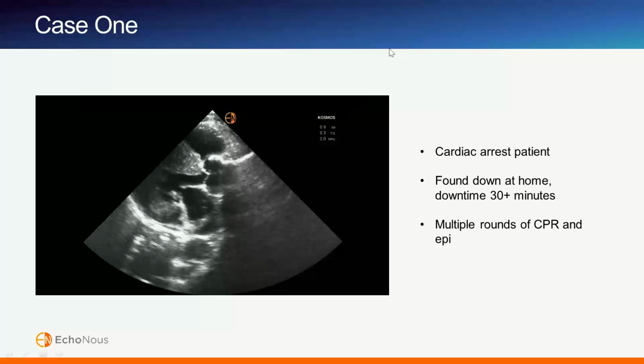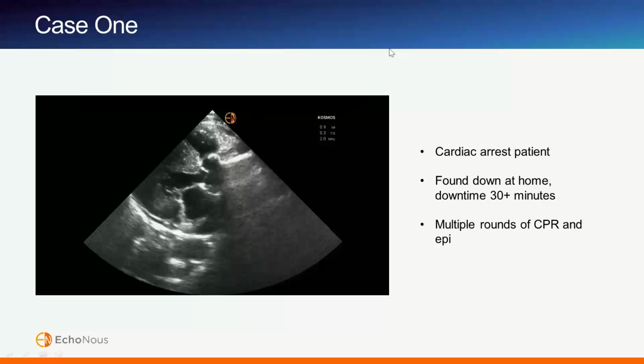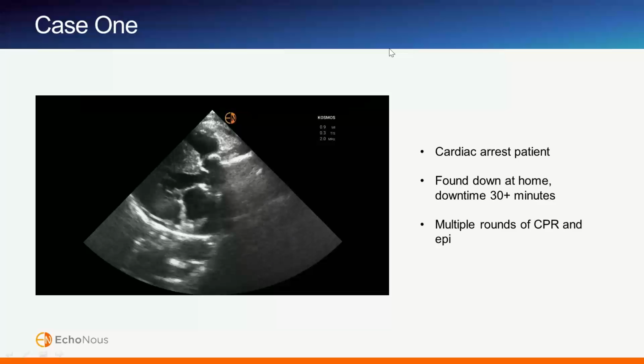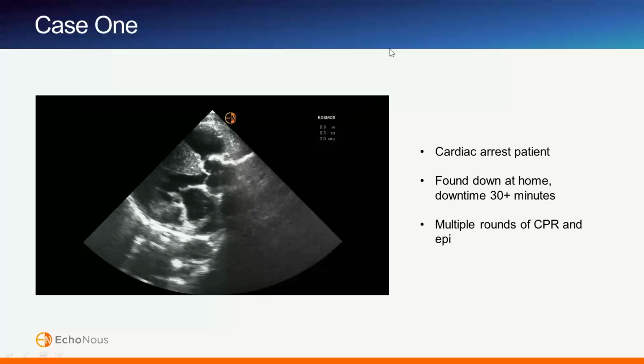Yeah, and for me at least, looking at this, I almost feel like I am seeing some movement. Usually when I'm doing a cardiac ultrasound, and especially in a cardiac arrest patient, I'm looking for an effusion because maybe this patient needs a pericardiocentesis at the bedside, or a large RV because potentially this is a PE and I need thrombolytics, or some significant wall motion abnormality. Is that sort of like the differential you had at this time?